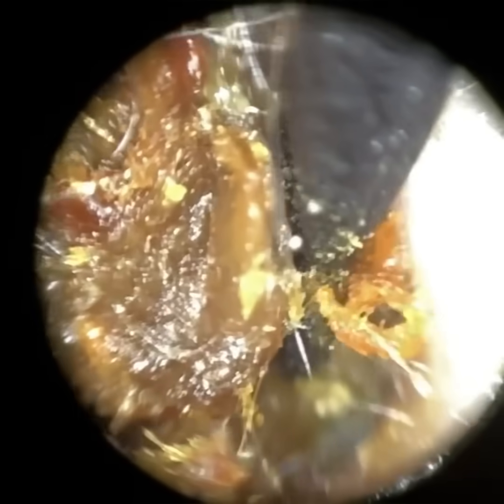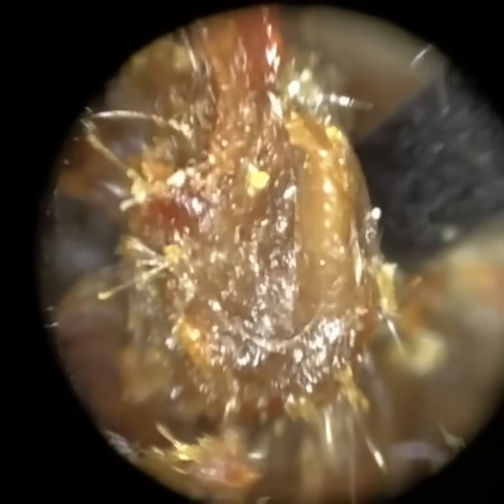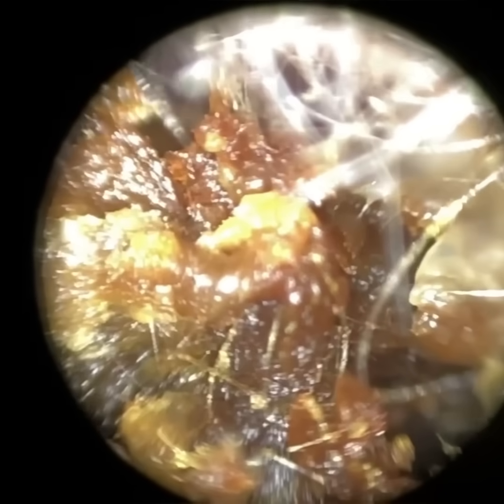Now, I initially performed microsuction, but as you can see, this wax and keratin plug was so strongly adhered that the suction was doing very little. So I've decided to remove this wax and keratin plug manually — or sometimes what we call mechanically — using ENT micro-instruments. I'm just using the new Rykerette here, and with the WaxScope, compared to the iClearScope, you can really see the curvature and the angulation of the curette, and also the arc.